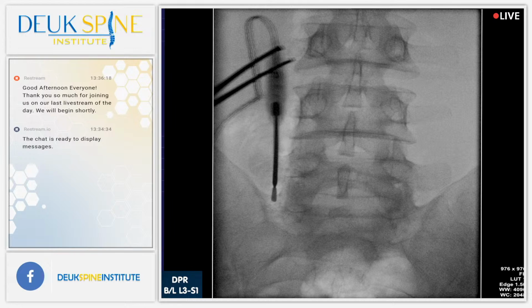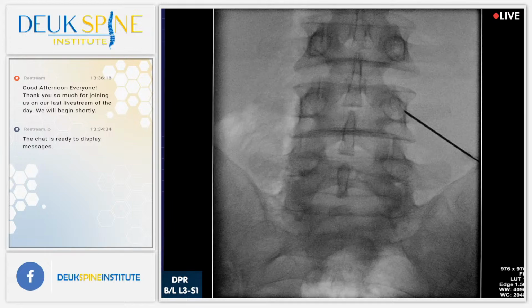You have a roll? No? It's fine. All right, so I got to go up.